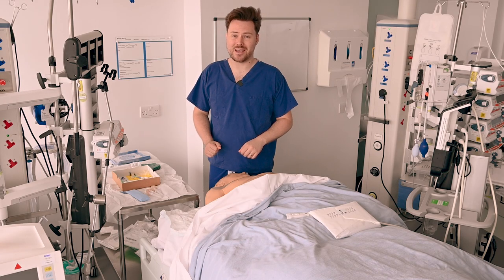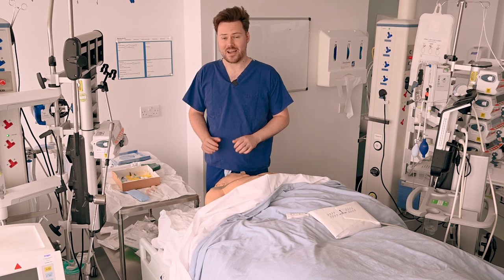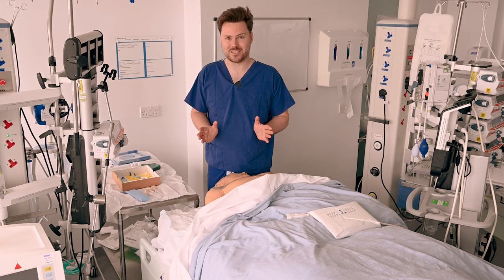Hi, my name's James. I'm one of the intensive care doctors here at Chelsea and Westminster. I'm going to take you through how we insert a central line.